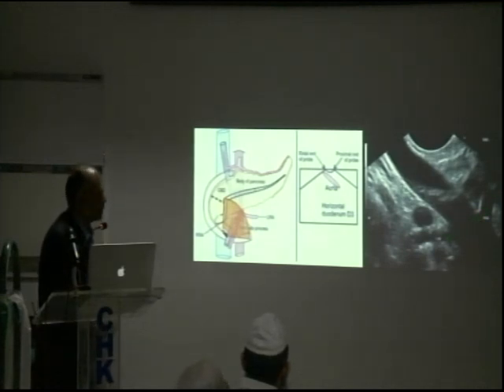Yeah, this happens in the books and all those things. If you're unable to get that, don't try to get that. As I said, do not try to fit this template in the third part. So if you can't get it, fine. But as Dr. Khalid has yesterday shown you in the live demonstration, if you can identify the aorta, that's enough. That would orient you, so you would have 2 structures on this side, 2 structures on that side.